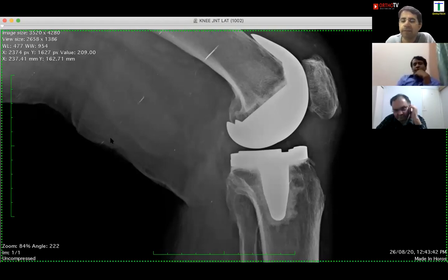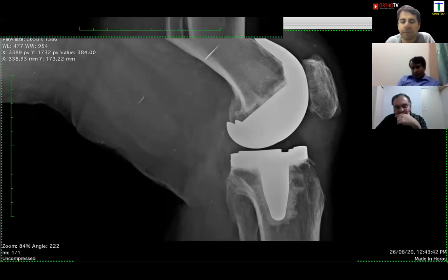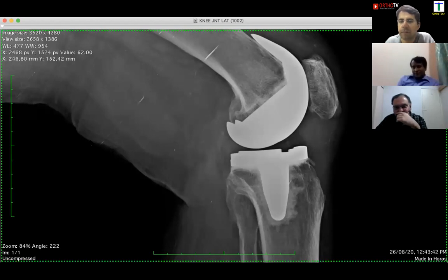Actually, in these cases, your judgment on table is very important. If you feel a little tightness is there, maybe you just take an additional distal femur cut. If you feel tightness in extension, make sure that you get an extension. Especially in male patients, if they have a preoperative deformity of around 20-30 degrees, try to get a neutral alignment. Post-operatively, if they have a little 5-10 degree FFD, male patients don't stretch out.